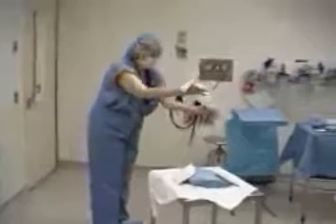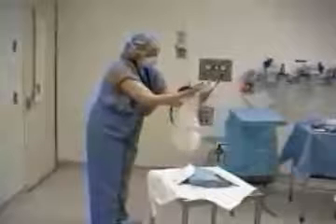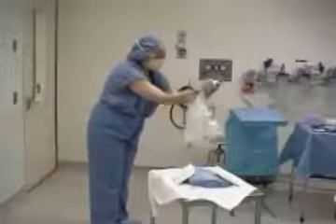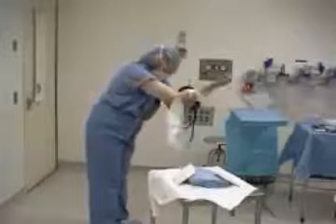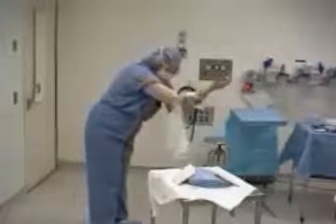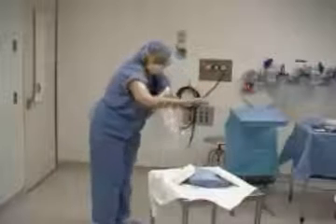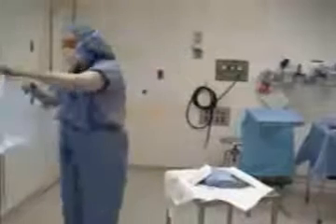Bring your other hand underneath where the dried part of the towel is and do your other arm. Again, starting with the fingers. Take your time. Work your way up the arm and avoid bumping the towel against your scrub suit. Give the towel to the circulator — put it in a trash can. Do not wander around with it, but do not throw it on the floor.